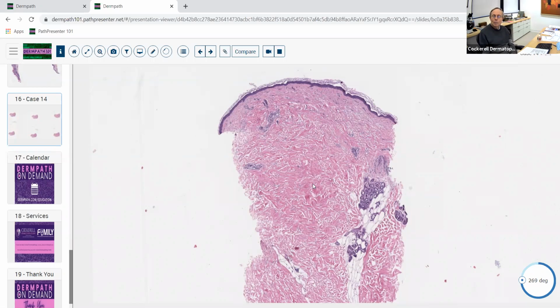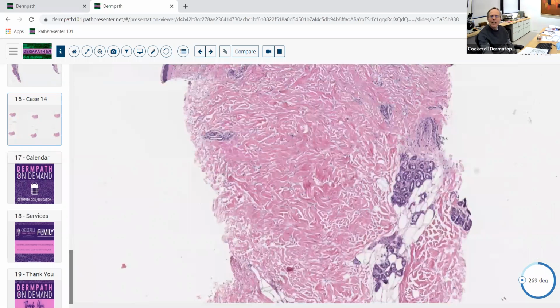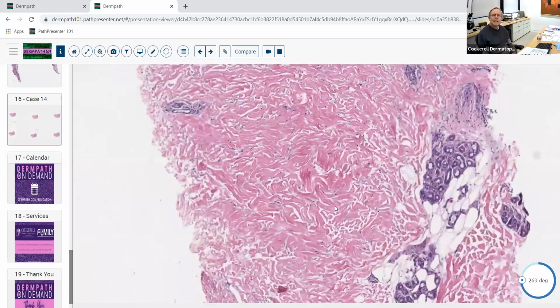And if you see these patients clinically, you'll feel their skin and you'll actually feel kind of a drop off. It's almost like a shelf. And basically what happens there is the sclerotic collagen gradually gets reabsorbed and degenerated, and they're left with atrophy where they once had the thick sclerotic collagen. You can still see there's some suggestion of some of that here. This collagen is still somewhat thickened. It's not quite as sclerotic as we saw in the earlier lesions that we looked at.